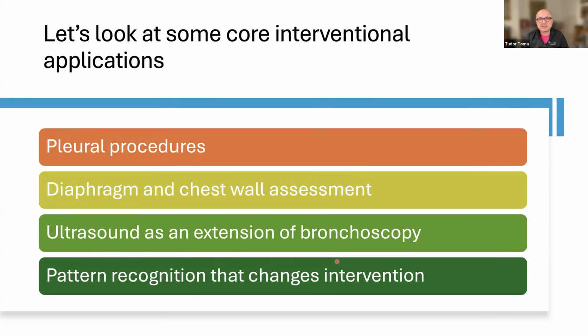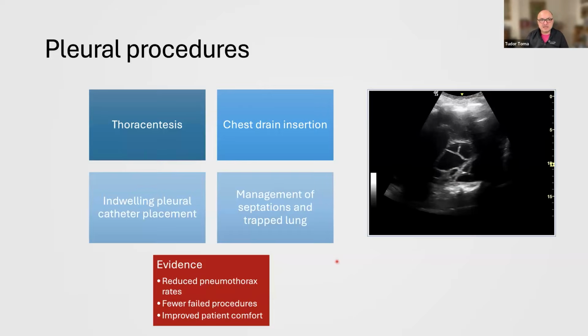They actually initiated the use of thoracic ultrasound on a large scale in respiratory medicine. And you all know that now it's basically compulsory to use thoracic ultrasound if you want to do a thoracocentesis and also if you want to do a chest drain insertion.